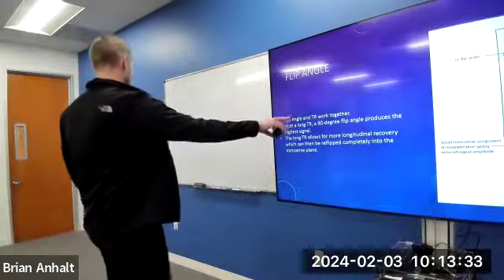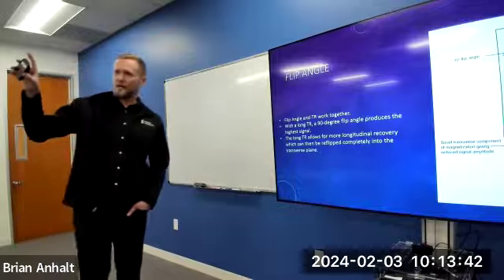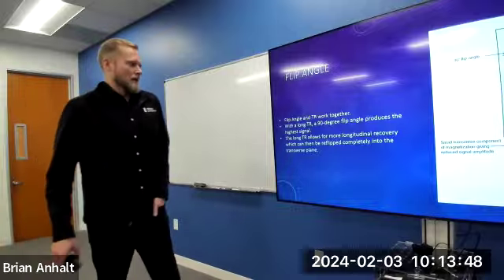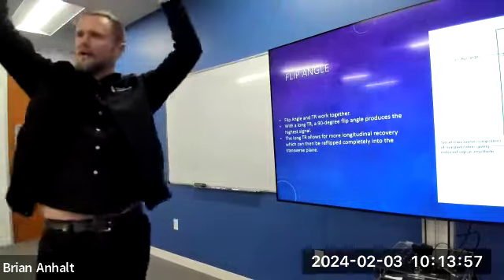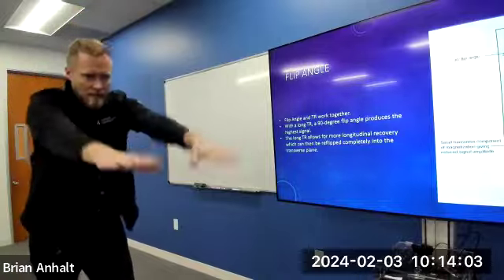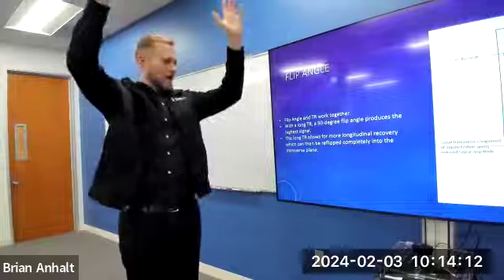TR and flip angle work together. You know this, right? If we have a short TR, we have to change that flip angle to either allow full recovery and eliminate T1 contrast or to get T1 contrast, right? However, with a long TR, a 90-degree flip angle will produce the best signal for us, right? Long TR means full longitudinal recovery. Therefore, to get the most transverse magnetization, where do I need to flip it to? 90 degrees, right? That's where I'm going to get my most SNR right there. The long TR allows for more longitudinal recovery, which can then be reflipped completely into the transverse plane.